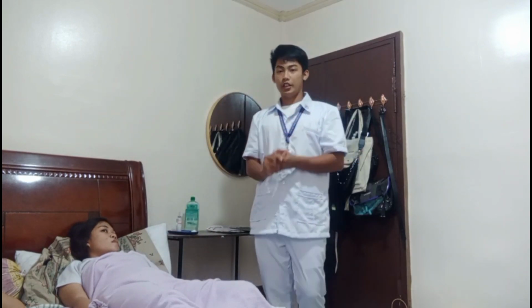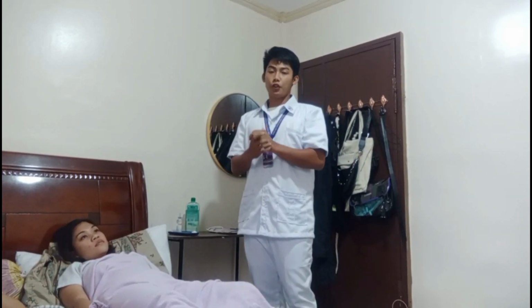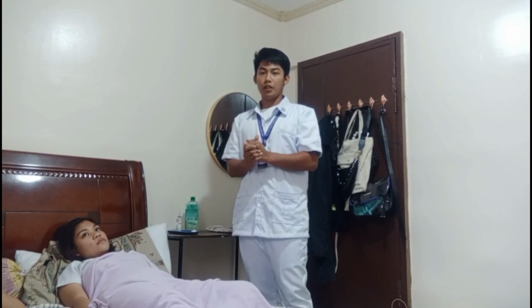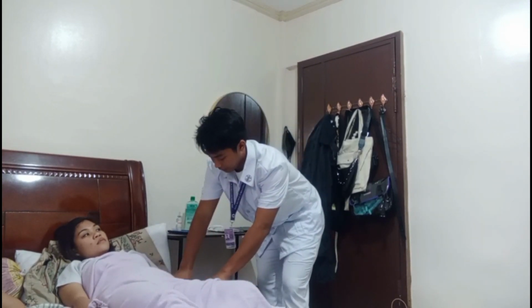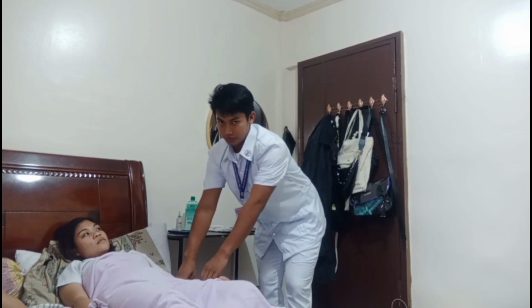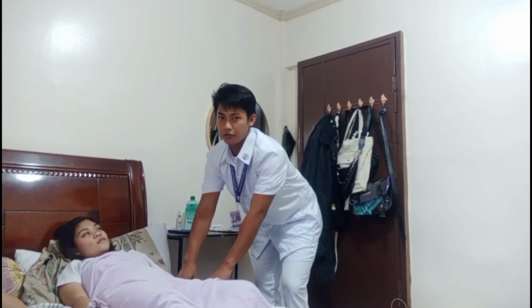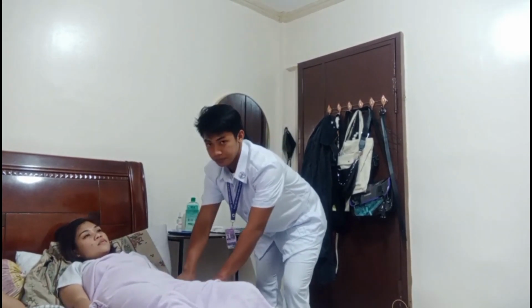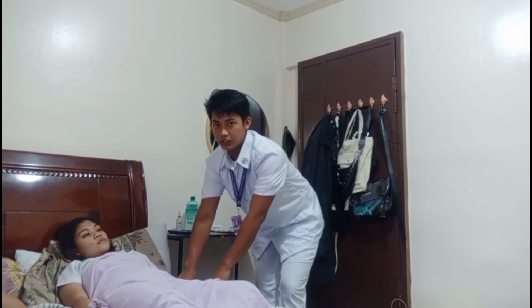Okay, now choose an injection site free of lesions. Select the site 3 to 4 fingers width below the antecubital space and one hand above the wrist. The forearm is a convenient and easy location for introducing an agent intradermally. Position the patient's arm so that the elbow and forearm are supported on a flat surface.